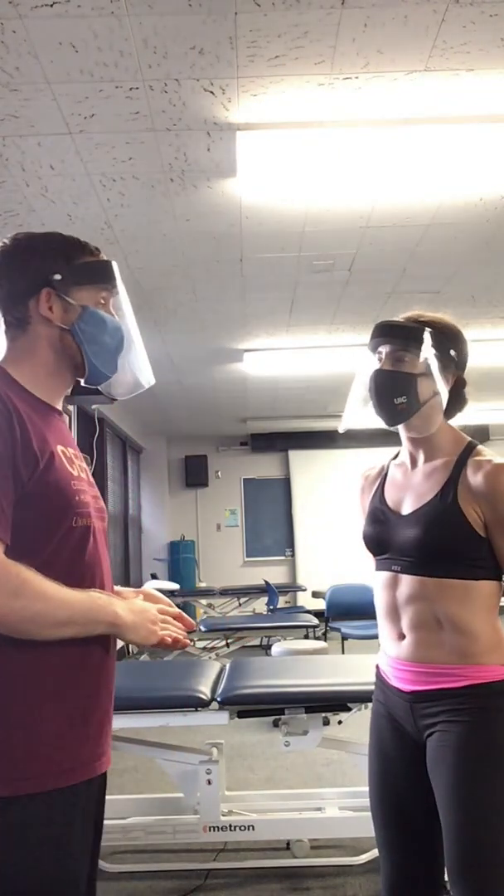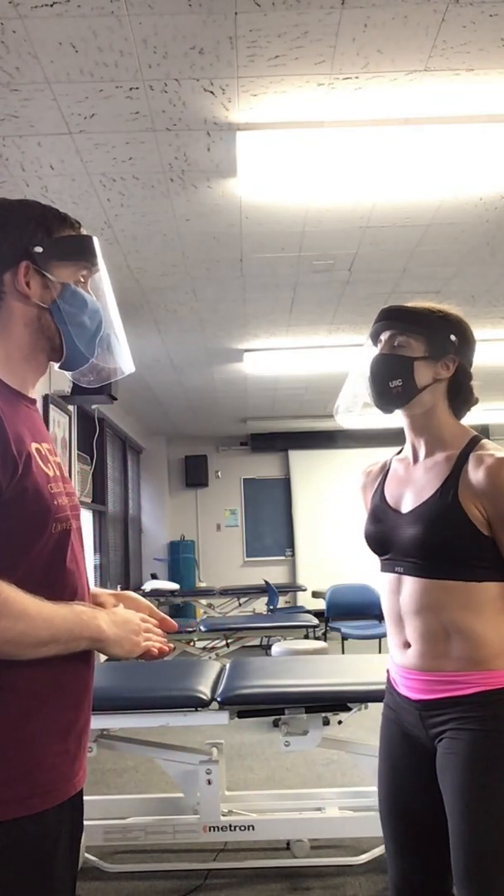Hi, my name is Zach. I'm a student of physical therapy. Can I confirm your name and date of birth? Jenna Walters, 5-28-83.